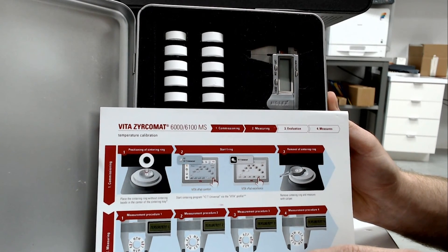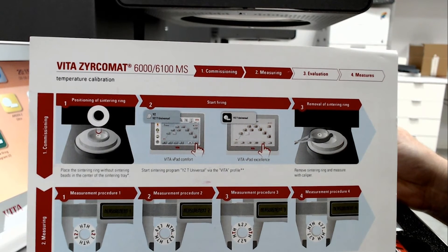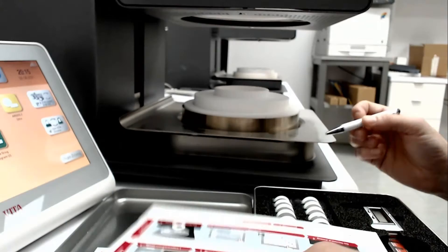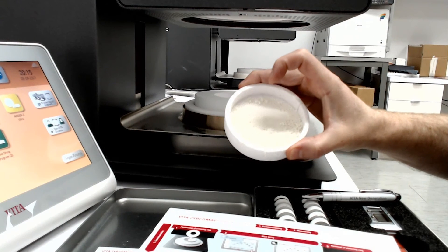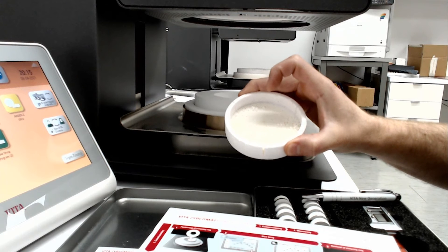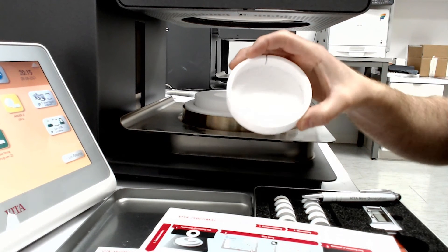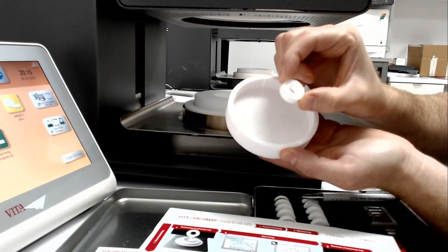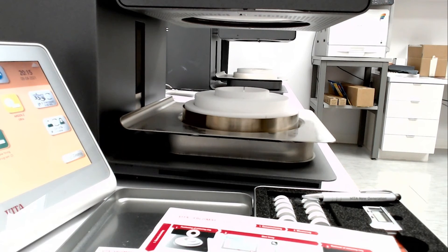I'm going to walk you through this to show you what it looks like. To start, we want to put a single one of those calibration rings in the center of our tray, but without the beads in it. Typically in our crucible we would have the zirconia beads. We don't want to throw these away — we just want to transfer them out into another container. Then we place a single ring in the center and put it into the sintering unit.